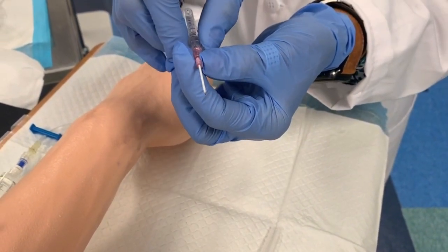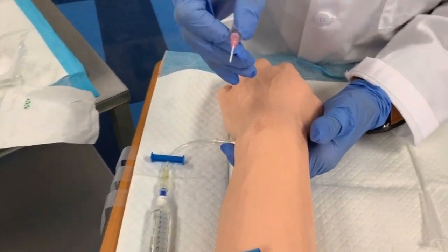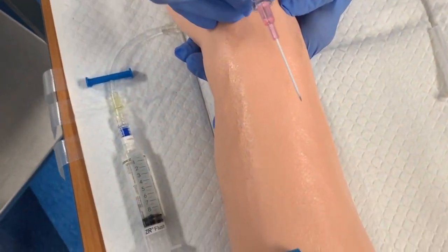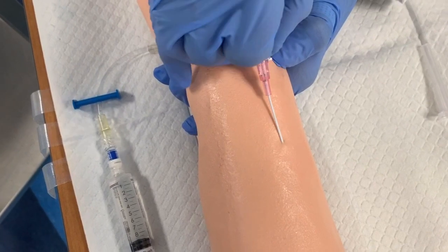Don't pull it back too far, you'll engage the safety device. Make sure you let your patient know you're going to stick them. Don't surprise them with the stick. Okay, Mr. Pena, going to go ahead and get started here. You're going to feel a little poke here. Get that bevel under the skin.